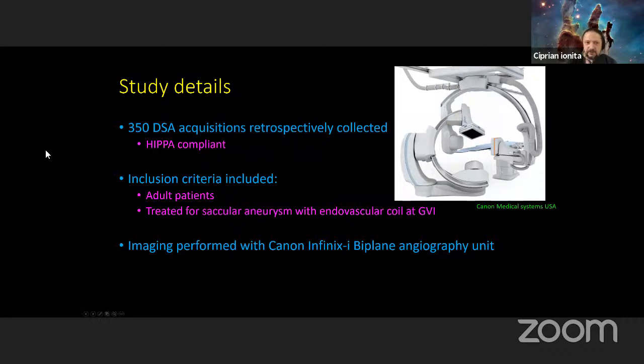So first of all, how do we tackle aneurysm identification, or lesion identification? You can apply this again for any kind of lesion. You can do it for AVMs, for intracranial disease, stenosis, and hemorrhages. So we took 350 DSAs, and again, this is our limitation.